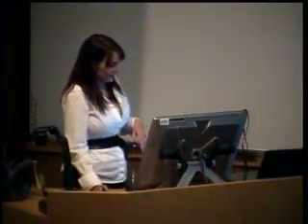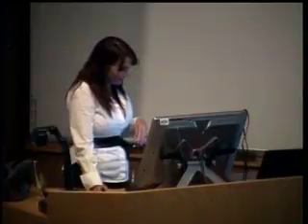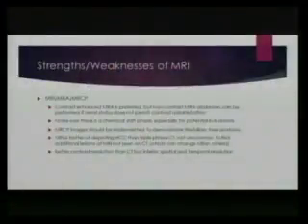However, if you're evaluating hepatocellular carcinomas, it is fairly frequent that we'll find an additional lesion on MRI that we did not see on CT. And so, that can, of course, affect the Milan criteria and change the staging of the patient and bump them up or bump them down the list. So the strength of MRI is going to be your better contrast resolution, but it has inferior spatial and temporal resolution.